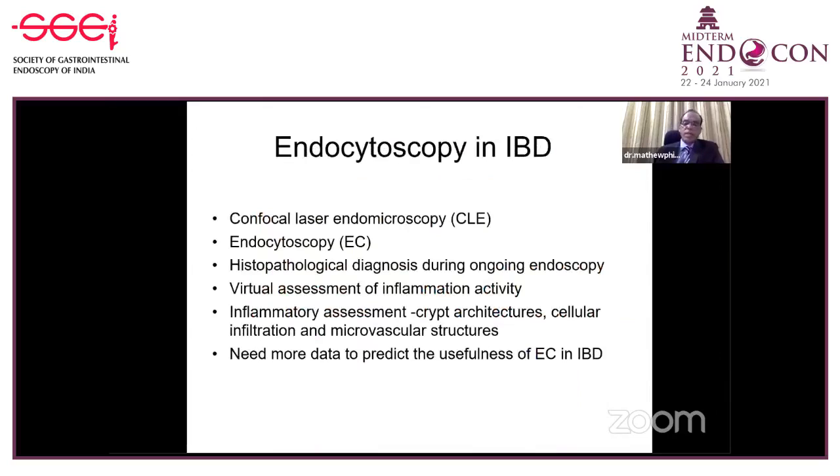So are there any other emerging areas where we can utilize endocytoscopy? Probably IBD is one of those areas, where there are some studies saying that confocal laser endomicroscopy and endocytoscopy can in fact look at the inflammatory activity of patients with IBD in the colon, and they found that probably you can make a virtual assessment of inflammatory activity. And how is it going to be relevant?